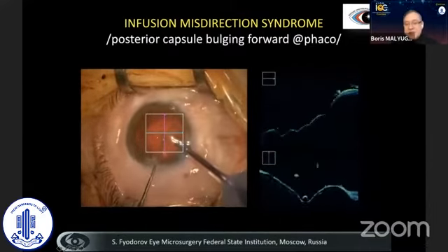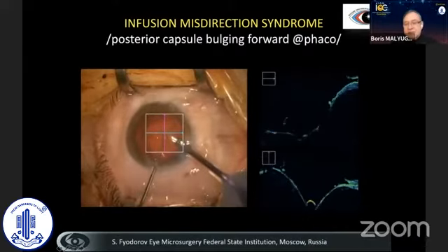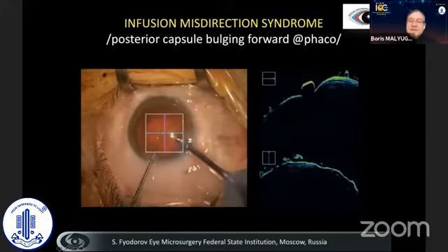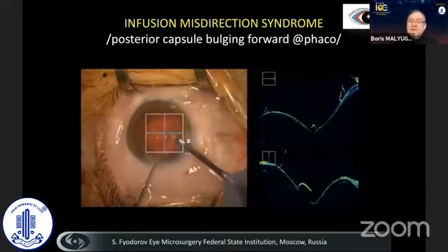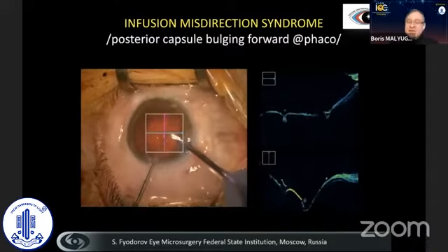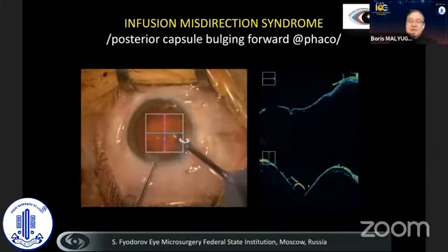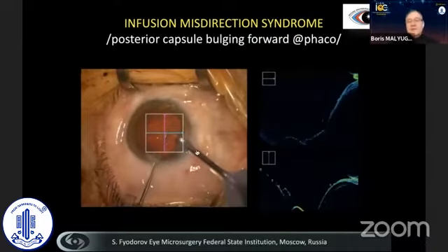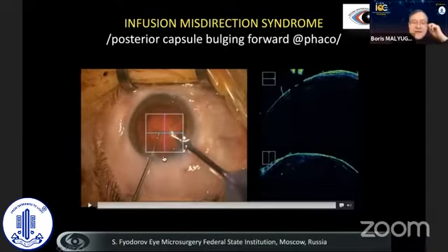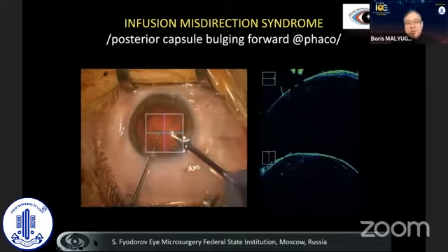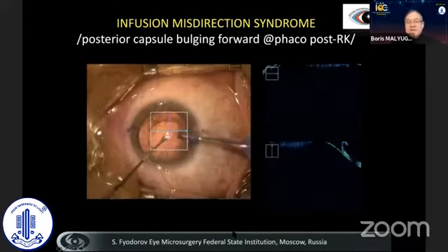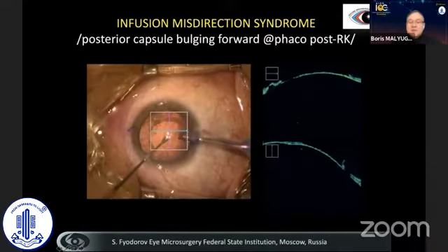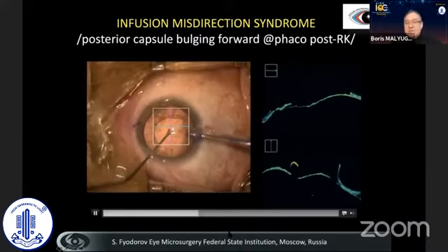As you can see here, even by compressing on the posterior capsule, this fluid is quite strong, representing that the pressure behind the posterior capsule is slightly higher than the pressure in the anterior chamber — probably because of outflow of fluid through the main and side port incisions. This represents that the balance of pressures between the anterior and posterior chamber is not perfect.